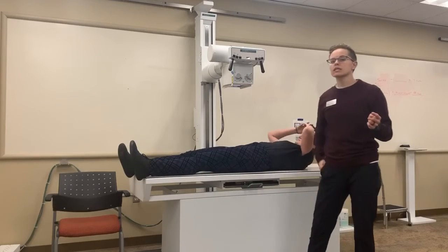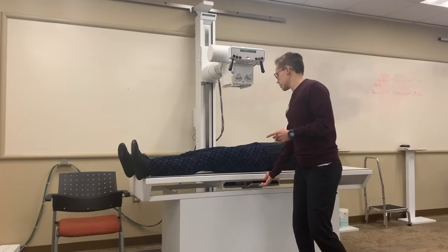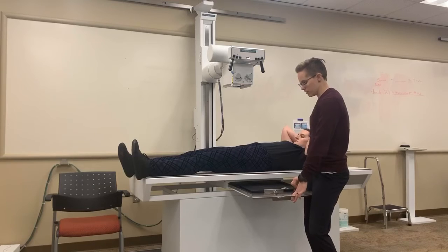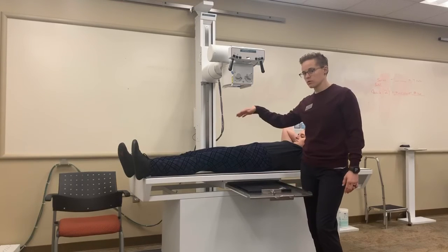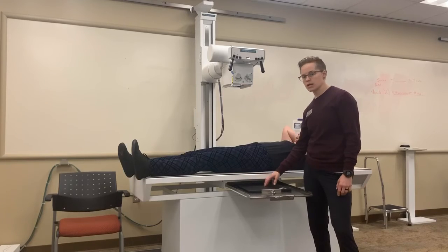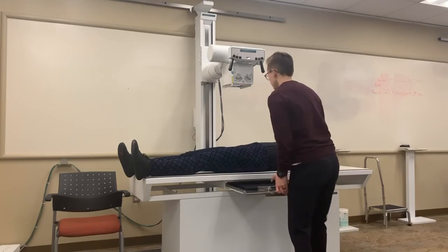I'm going to show you the accessory view, the AP spot hip, not part of our standard series. The setup is very, very similar to that of the AP frog leg. The leg position will obviously be different. My cassette is still 10 by 12 lengthwise, ID blocker up, still marking the affected hip.